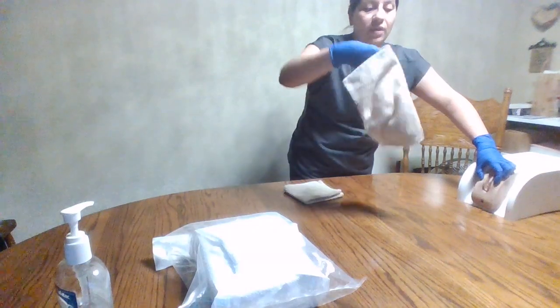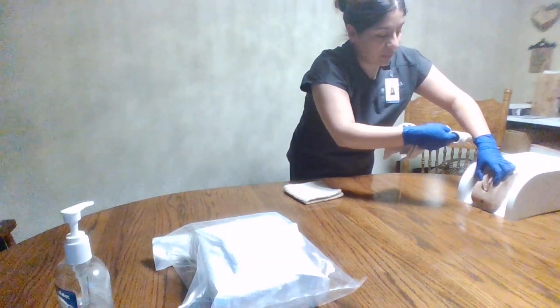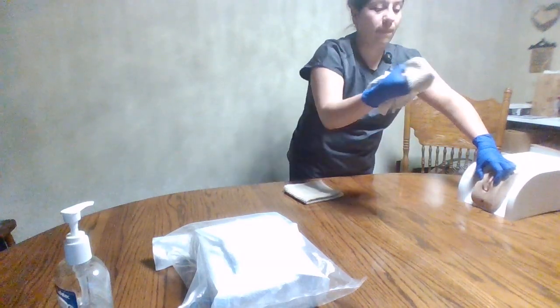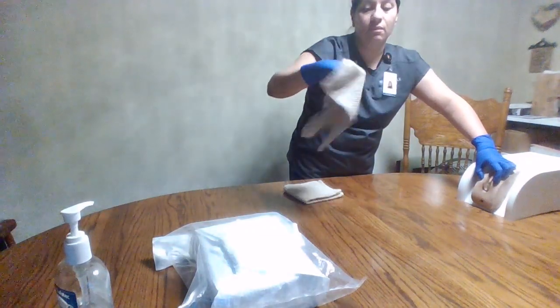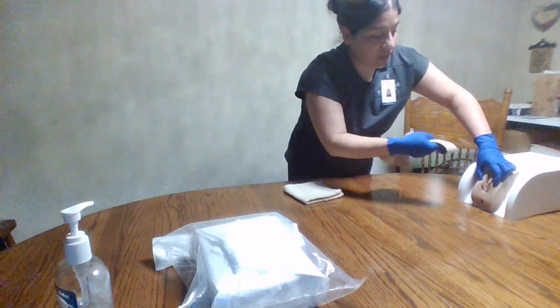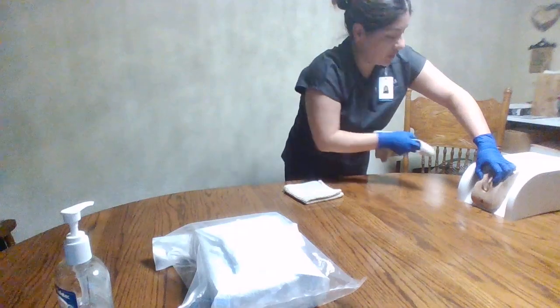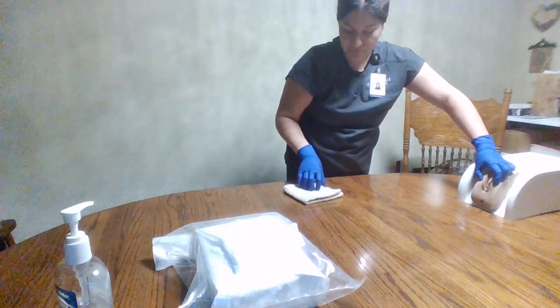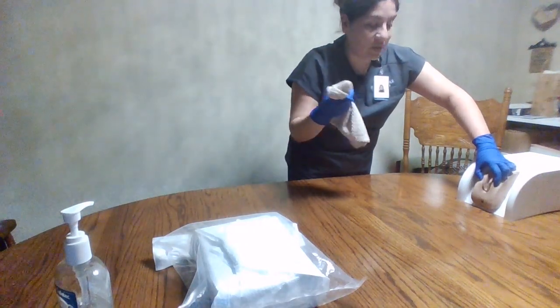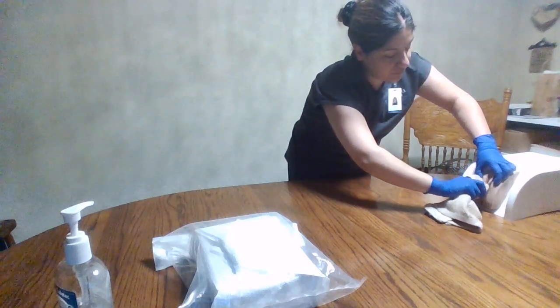Okay. And then I will switch corners, and then with the labia that is closest to me from top to bottom. And then down the middle from top to bottom, I will clean. And I will dispose of the towel in the trash. With the towel for drying, I will go in the same sequence from the labia that is furthest to me from top to bottom for drying.